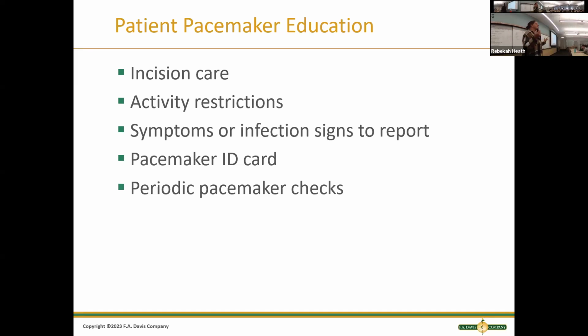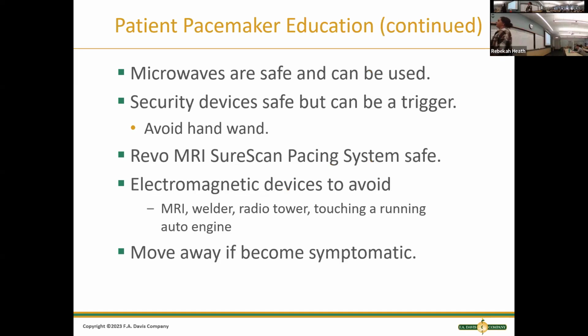Almost all the pacemakers now can go through MRIs or be scanned. Back whenever it used to be metal, you don't want to put somebody with a pacemaker in an MRI, right? That would not be safe. Microwaves are safe, right? But you never know what patients know or don't know. They might think, can't use a microwave anymore. I better get rid of all my refrigerator magnets. You know, they might just not know.